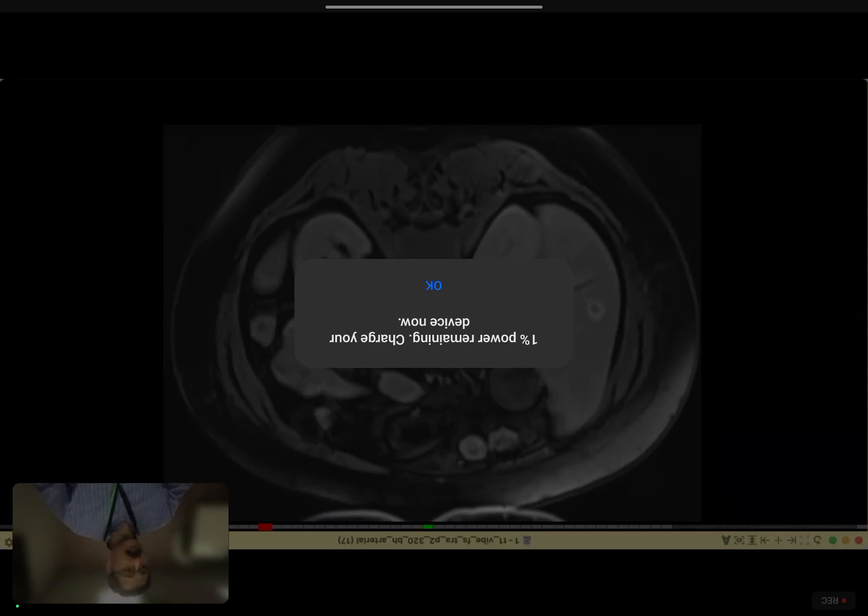So please remember, FNH is an exam case. Hepatobiliary specific contrast, though you might not have seen in your day-to-day practice. The problem with this is it is about 118 pounds, this one bottle of this. And the other one, I think, is 9 pounds or 11 pounds, something like that. It's very expensive. You cannot use it with each and every case, but it has come in the exam. You should know this concept, and you have to ask the examiner that I want to see it on this phase.